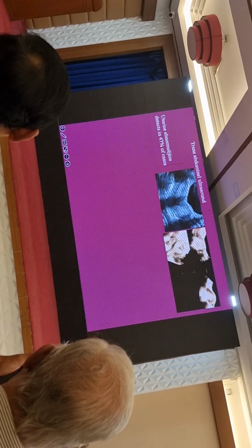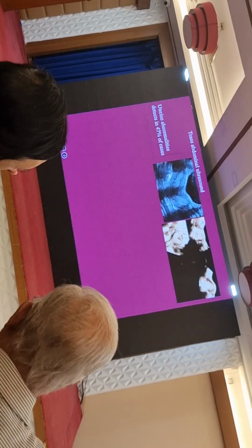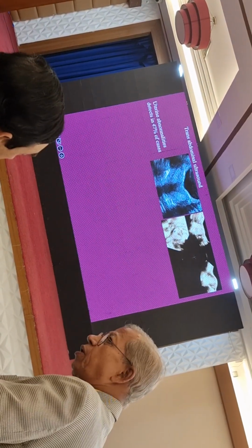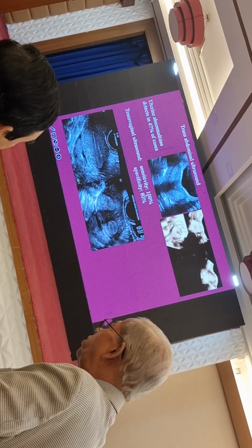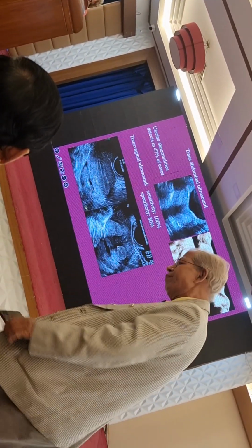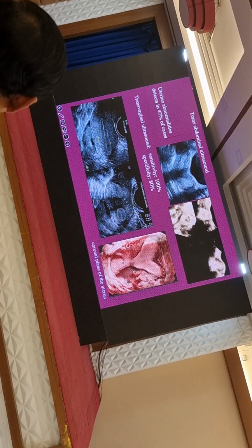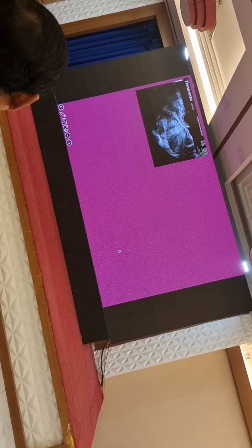Transabdominal ultrasound is not the modality of choice, but we still do it. It's very helpful, especially in a bicornuate uterus where the 2 cavities are far apart. And it also does help in this young girl, and this was a partial septate uterus. Endovaginal ultrasound sensitivity is about 100% and specificity is about 80%, and here we can see the 2 endometrial cavities. Long axis is not giving us any information, but unless we do a 3D, we don't get an answer. And we do a 3D and the coronal plane shows that it's a partial septate uterus.